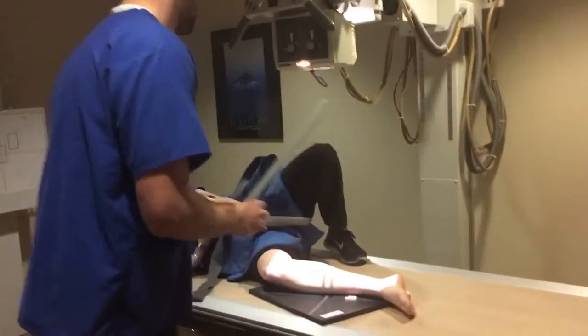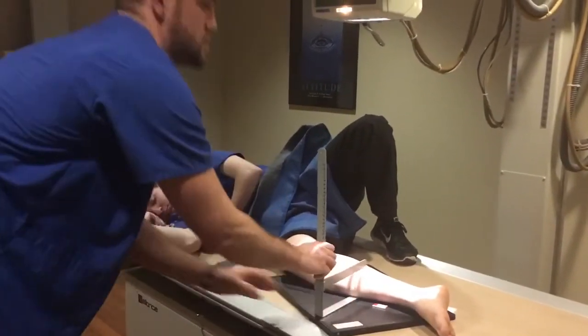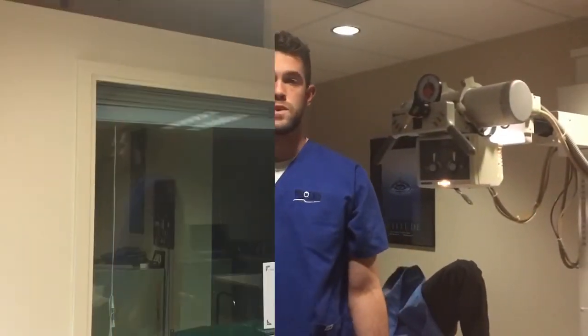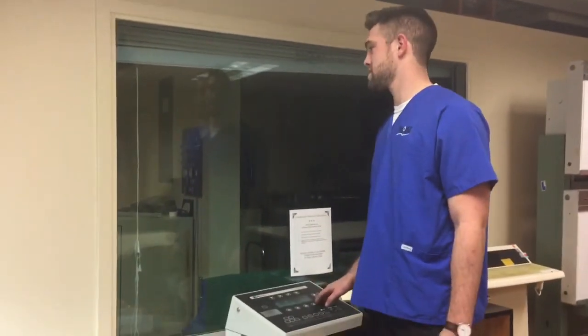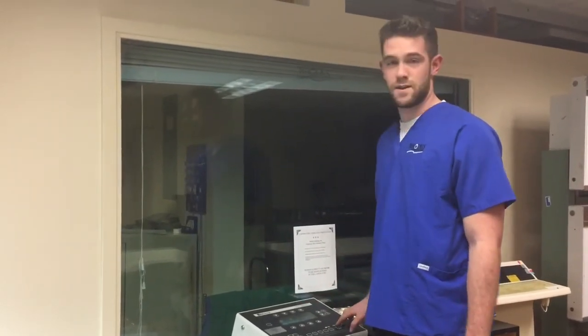I'll now measure the patient. It is a 9 again. And now I will shut the door and set the control panel. Since my patient had the same measurement, nothing changes on the control panel. So I would just make sure that the patient is still holding still, and I will take the exposure.